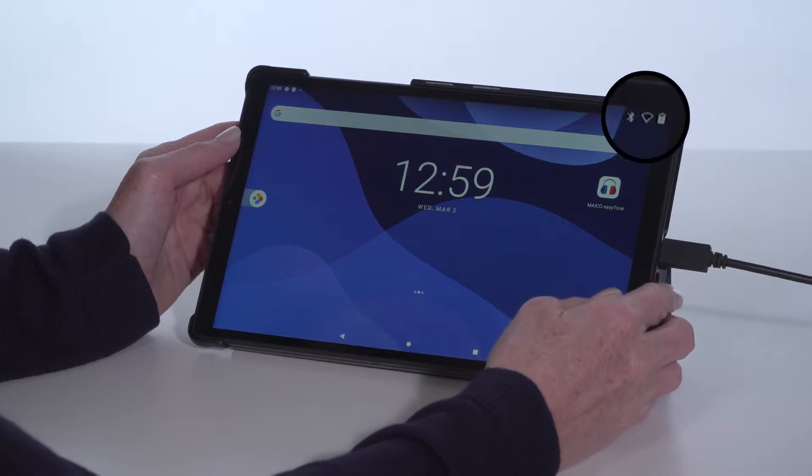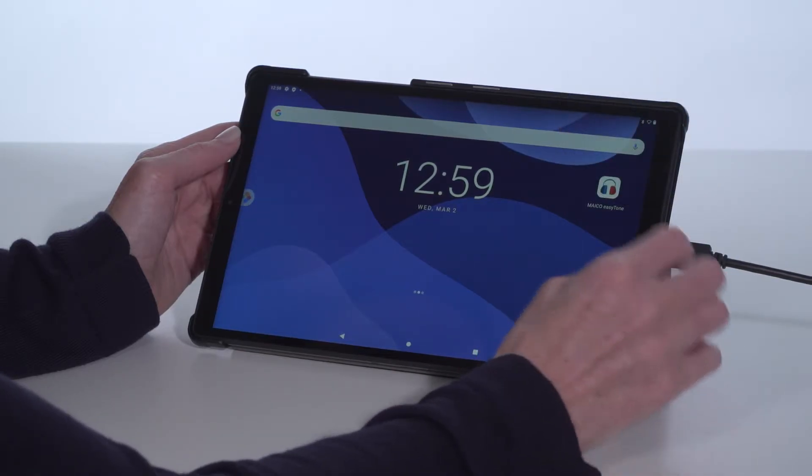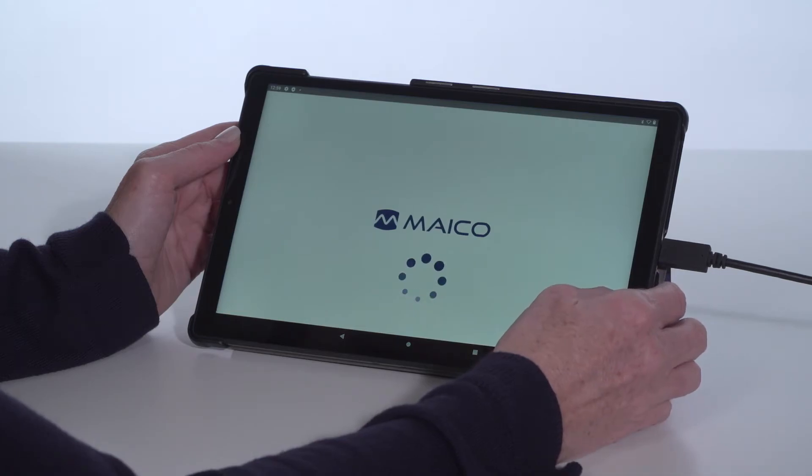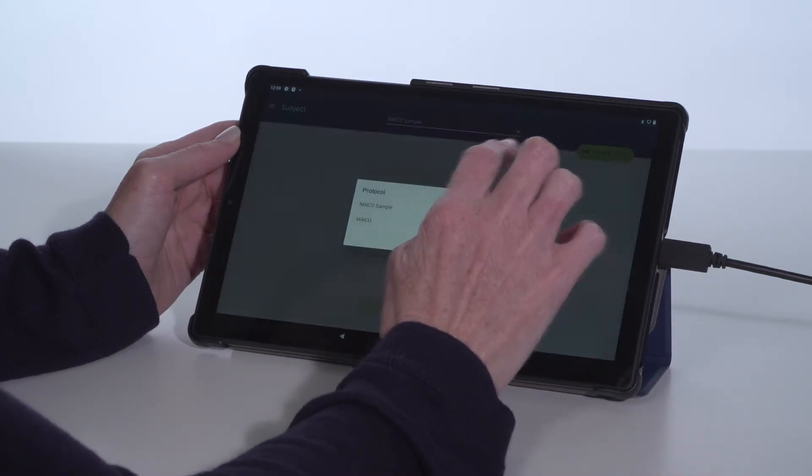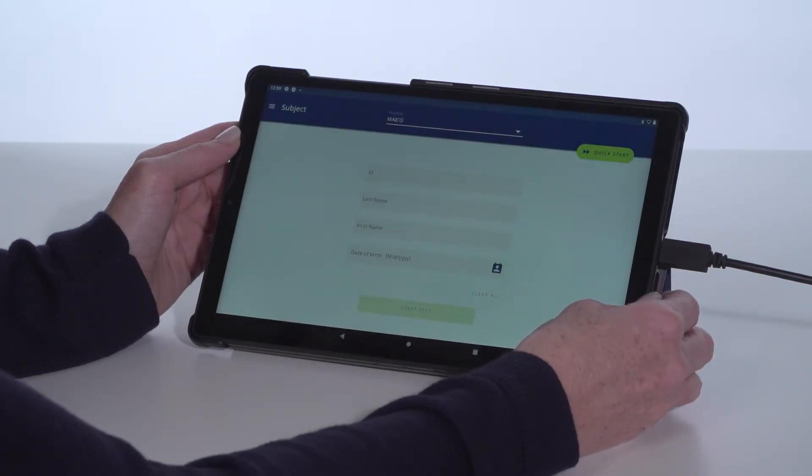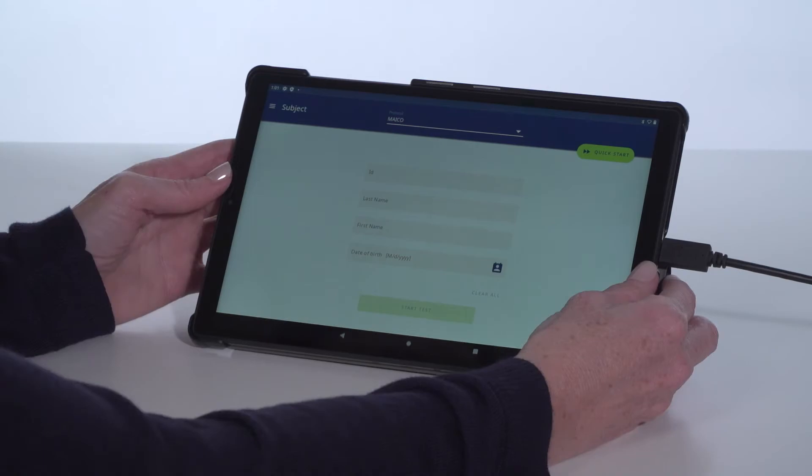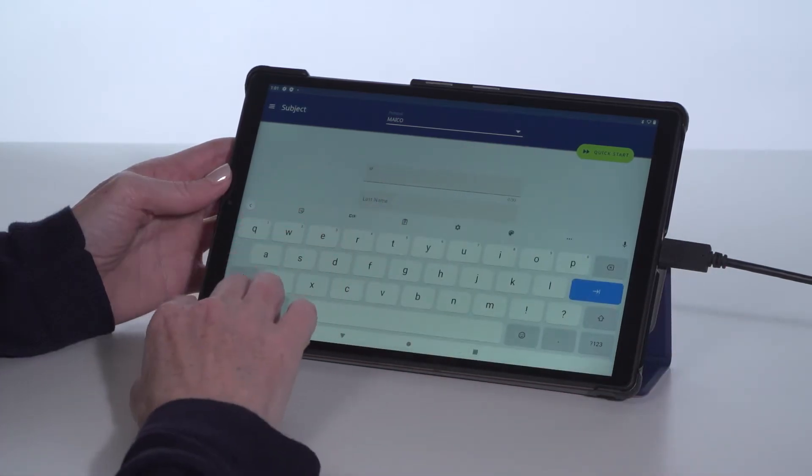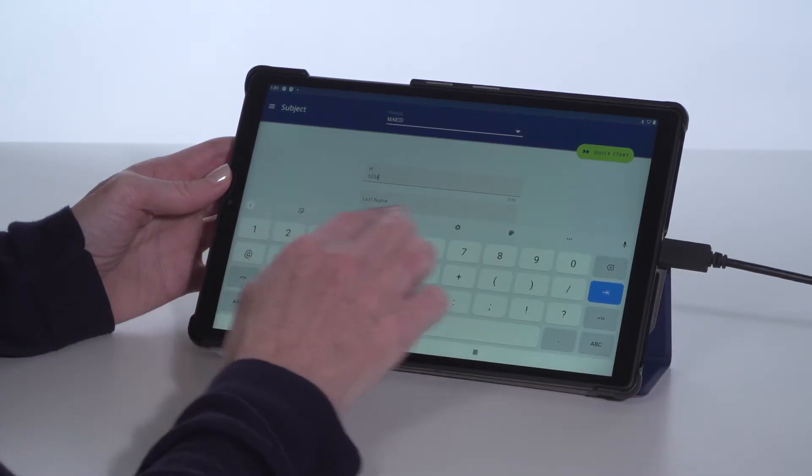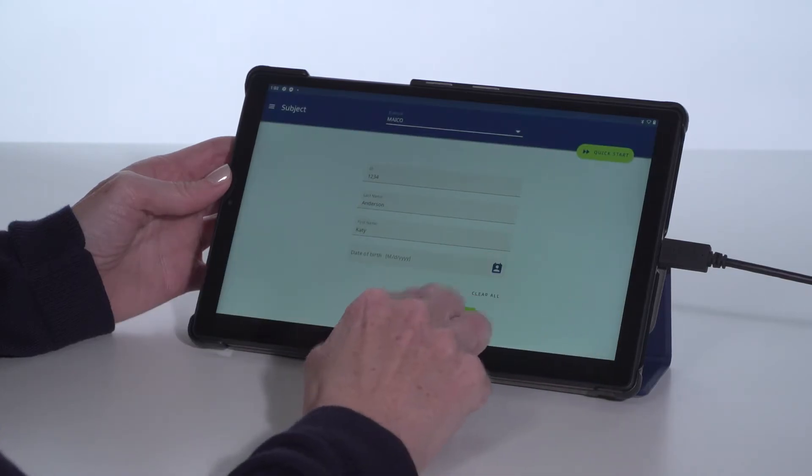Before using the device, make sure the tablet is fully charged. Select the EZ-Tone app and confirm or change the testing protocol from the drop-down. With the single screen setup, enter the subject information into the tablet and select Start Test.